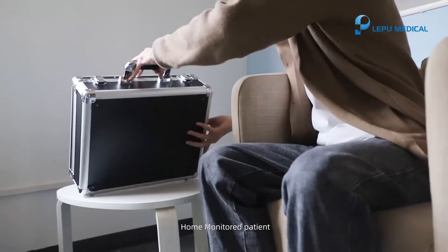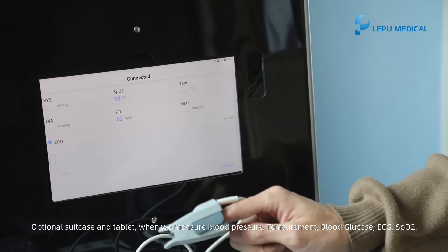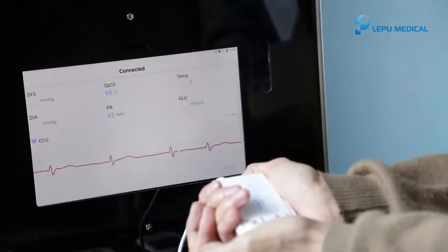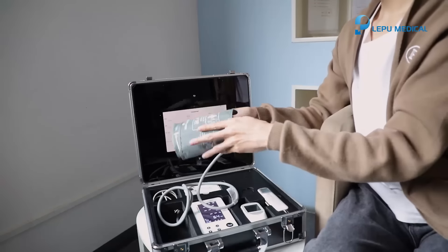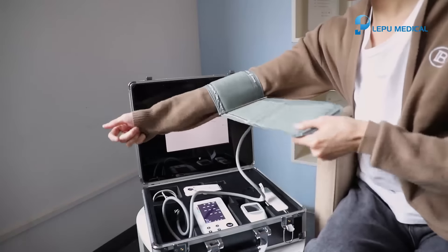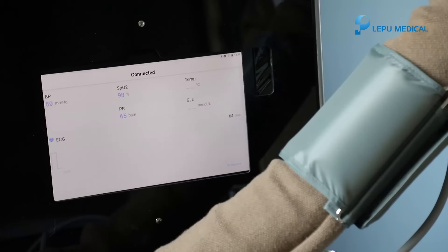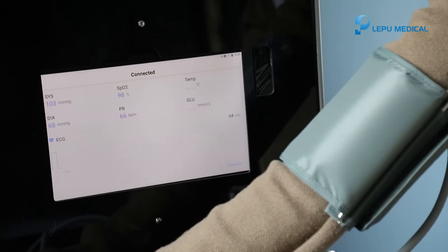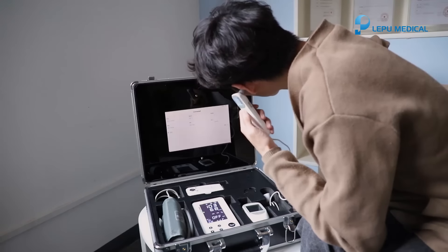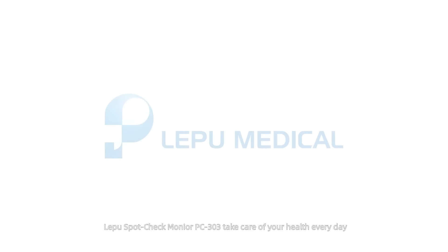Home monitored patient. Optional suitcase and tablet. When we measure blood pressure, temperature, blood glucose, ECG, and SpO2, data can be synchronized to the tablet for more convenient use. Let the SpotCheck Moneyer PC-303 take care of your health every day.